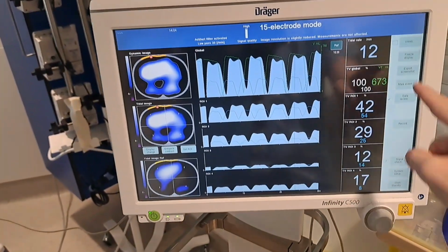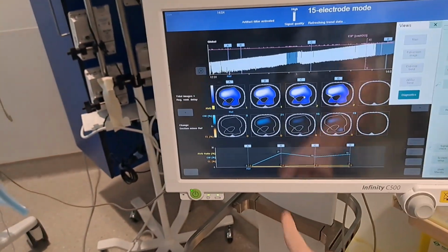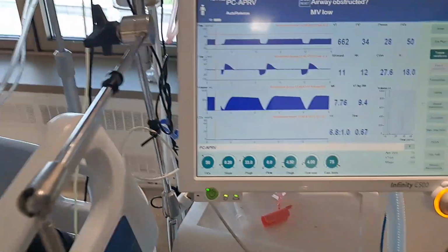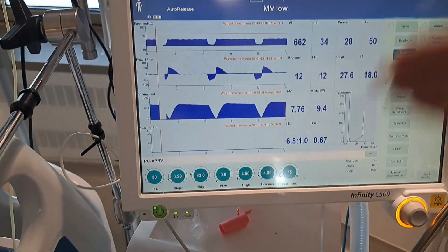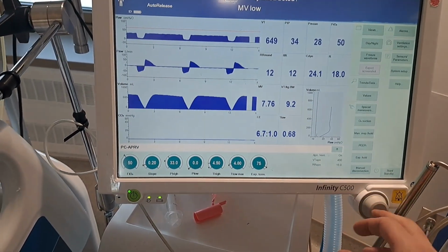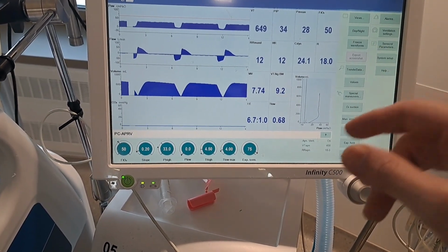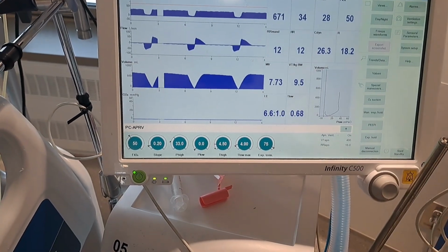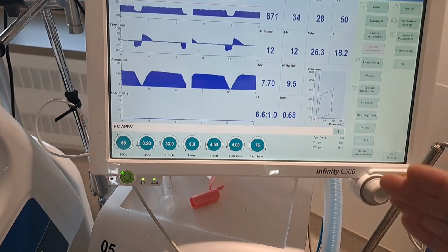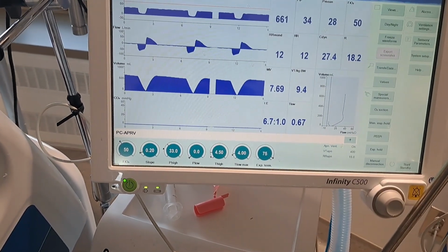I was continually, when I was doing the titration, going from 30 right up to 40 gradually. I did 30 to 34 with the PulmoVista, the electrical impedance tomography, to do a P-high trial. I used the custom analysis instead of the PEEP trial. And from 30, 32 to 34, 34 was the best.